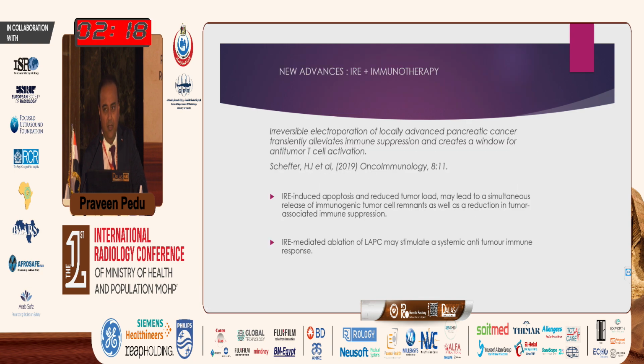So where we go with IRE, there are lots of research studies going on at the moment, both in the pancreas and in the liver, where IRE in combination with chemotherapy is supposed to enhance tumor response rates. This is something which we will know in the years to come. And again, IRE, particularly in the pancreas, is supposed to cause an immunogenic response. And if you supplement IRE with immune mediators, you tend to get better results. Again, this is research that is currently ongoing, and hopefully we'll know the outcome of these studies in the years to come, and we'll have a better understanding of where IRE can be used.